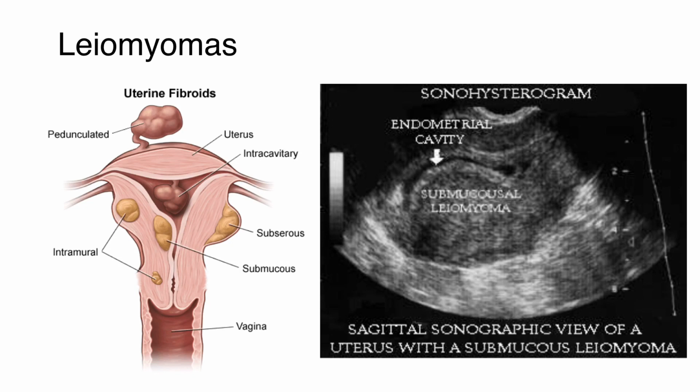And here is a sagittal sonographic view of a uterus with a submucosal leiomyoma.